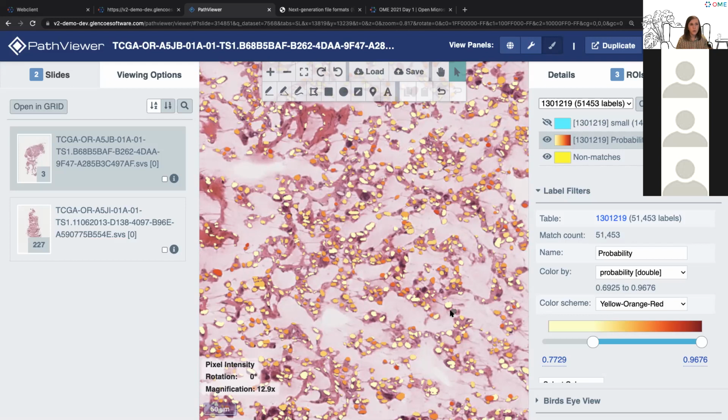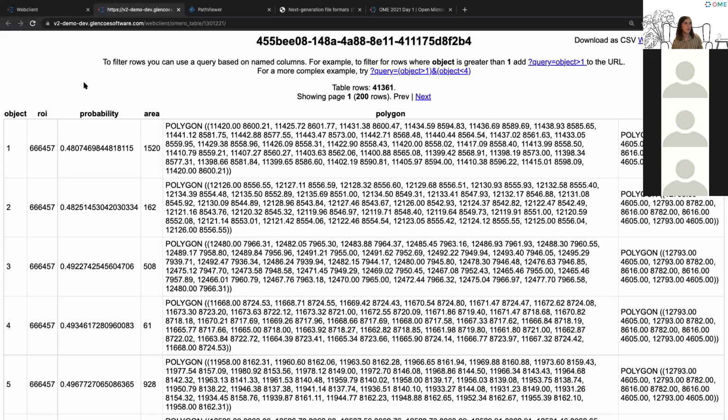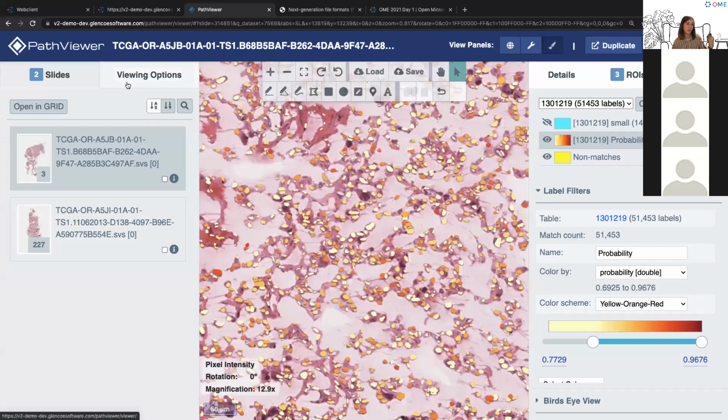And what you don't want to have to do is duplicate the relatively large underlying label image data that represents the segmentation of all of these objects. It's the same size as the original image data, and you instead want to be flexible in the data table that represents those objects. And on top of that, not only can you add a new table with new measurements or new classifications, what you're doing here is you're building new visualizations based on that data.